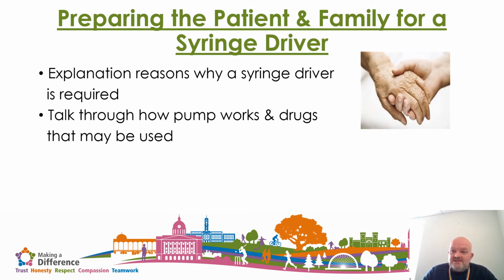Patients should not be asked over the phone to try and resolve the problem themselves, because we don't know if they do that whether they've done it correctly. So we don't know if the syringe driver continues to run or if it's stopped or whatever.